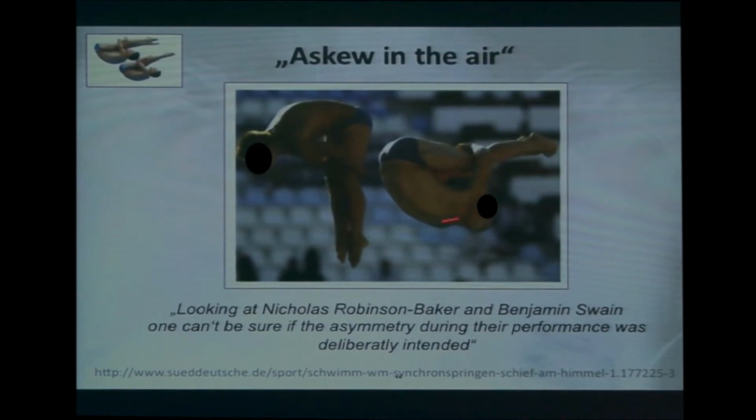And as you see here, these guys, they didn't want to look like that, although it looks almost like that. In these situations, you don't have synchrony at all. And that is a severe problem in non-invasive ventilation, and you can't avoid triggering delays and off-cycling delays with non-invasive ventilation if you are on a pneumatic trigger.